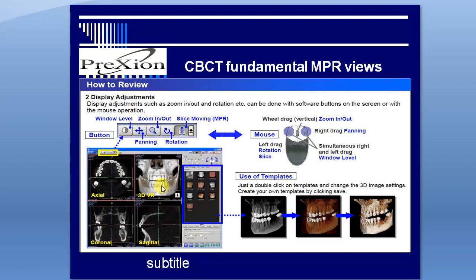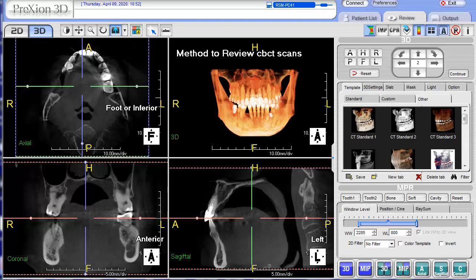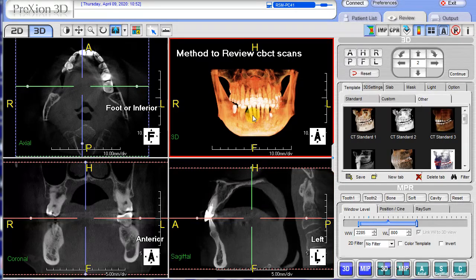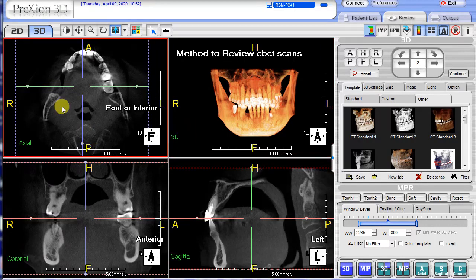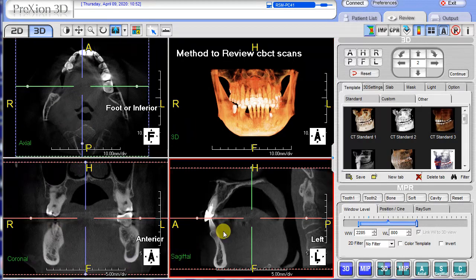3D and its templates. When the screen is loaded, this is your default screen: axial, coronal, sagittal, and your 3D rendering screen.